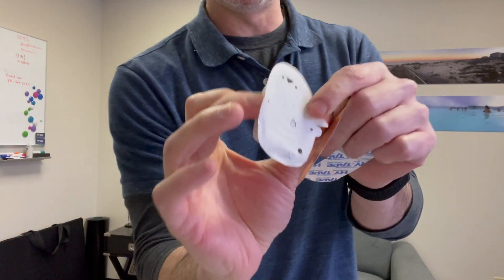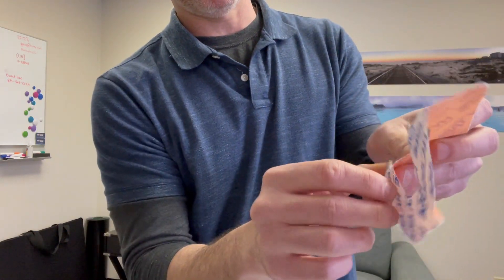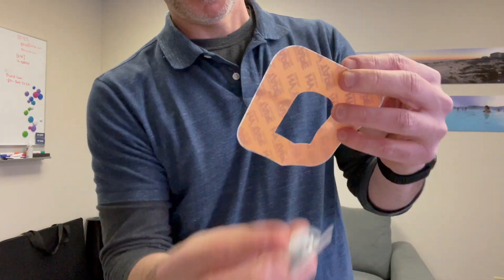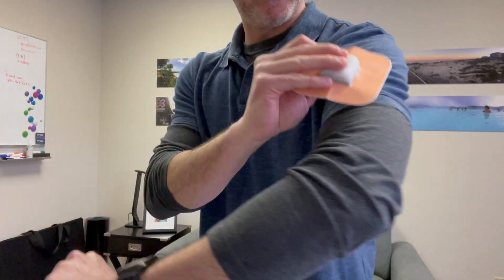What you don't do is pull the backing off here — you pull the backing off of the tape here like this. Then you poke this right through there and it'll fit right over your arm.